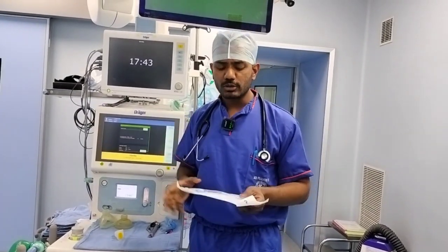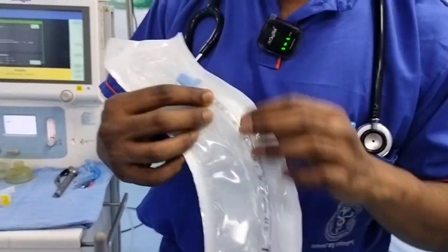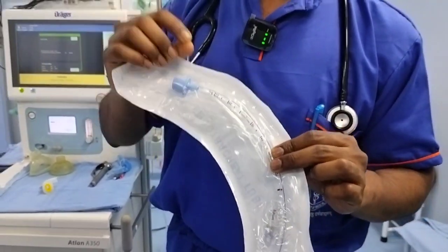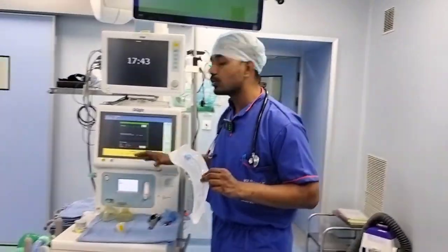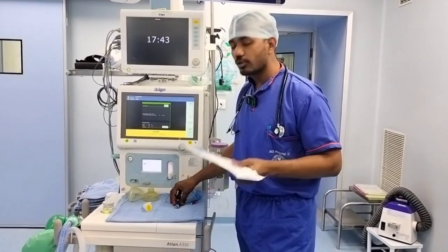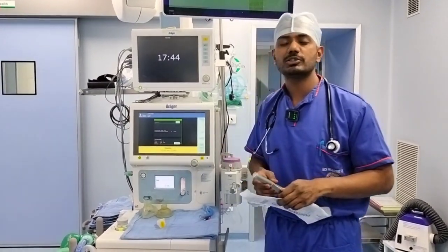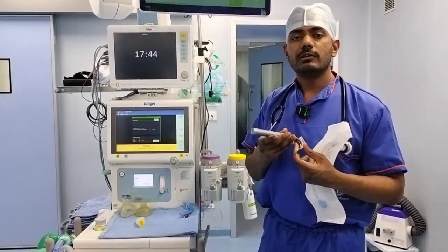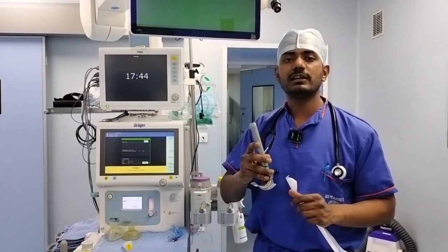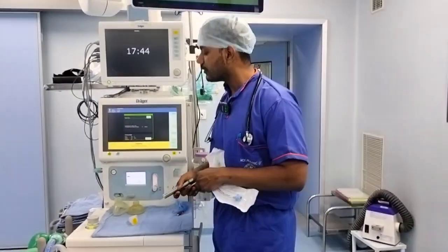Even for humans, we have the same kind of tube. This is nothing but a tubular structure. You can see, right? This tube is made of plastic, which is PVC. This goes into the trachea of the patient, through which we connect the ventilator and ventilate the patient. But securing this tube is not an easy task. It needs so much skill. We secure this tube through a process called laryngoscopy, for which we use a device like this, which is inserted into the mouth. This process itself has so many side effects.